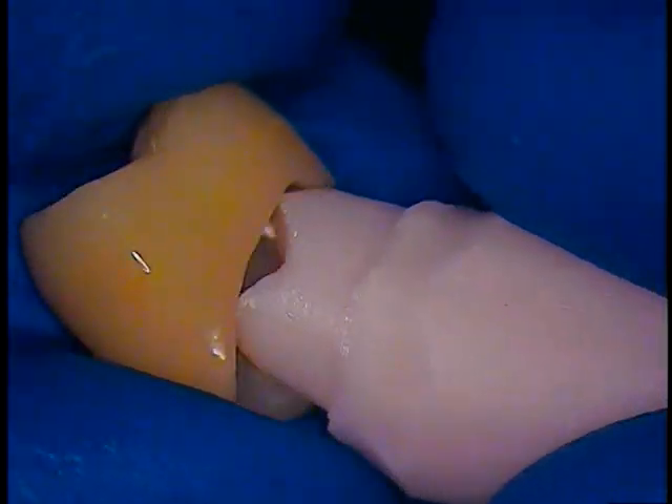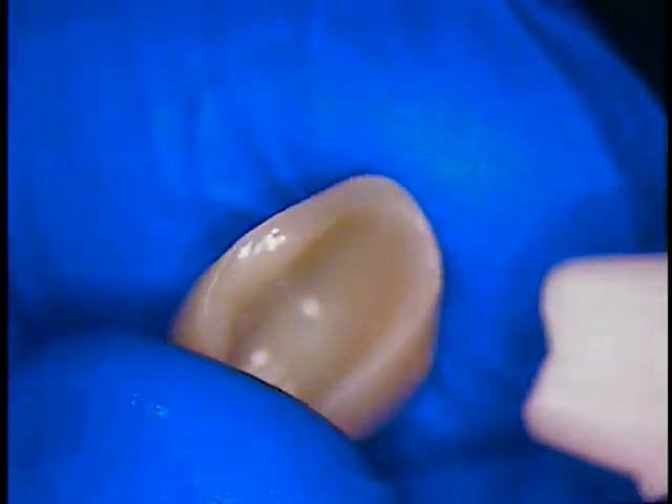While we're waiting, I'll talk a little about the other crown. When you're fit-checking, you're going to slide the... I need to find the right dye. These are your dyes — you get these with your case. This is a different dye altogether. So this is the other premolar. You can see where the adjustments are made and polished up for the patient's left side. This one's all ready to go, but we're going to do this after we cement the right side. Step at a time.